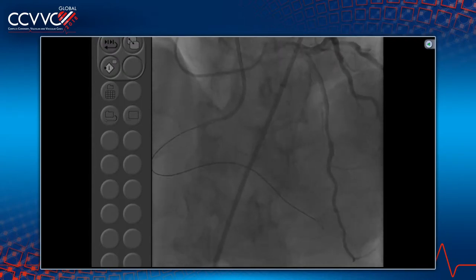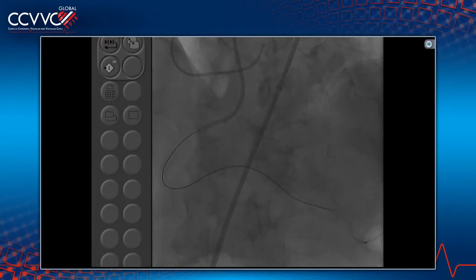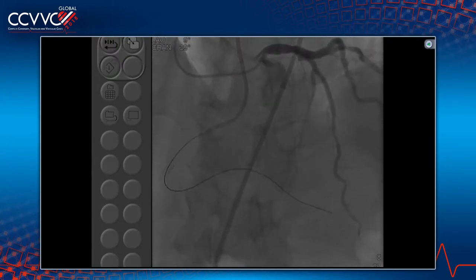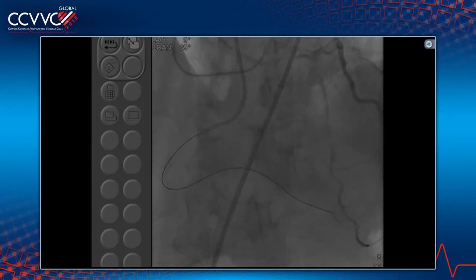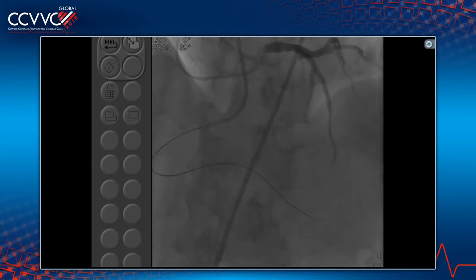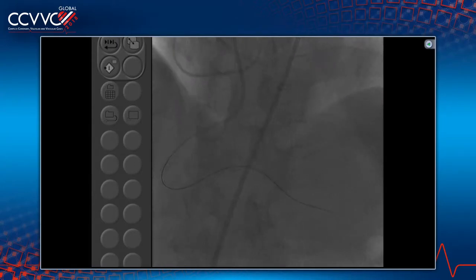Yeah, it's a beautiful cross. Perfect. It's beautiful, and actually, we know that it was intraluminal because it went first in the AV continuation, then took it back, then went to the RCA, to the PDA, and verification was through the stent, and now with the extra verification through the contralateral injection. So I just try to advance the microcatheter across. Same, if it does not go, you'll just do your corkscrew movements. See there? Just like you will do.